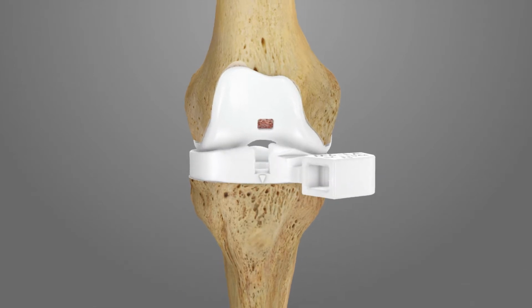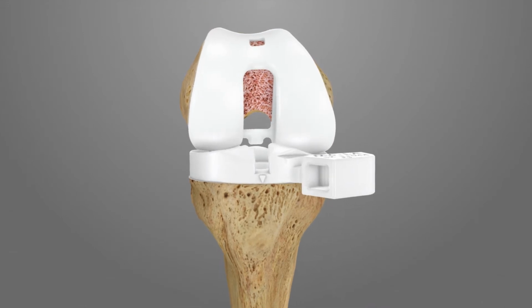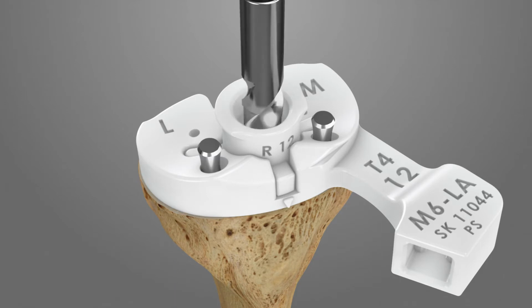Bring the joint through a range of motion and assess balance and ligament tensioning using the selected T4 iJig. If a thicker tibial assembly is desired, repeat with a larger T4 iJig. If the knee is properly balanced, pin the tibial preparation iJig into place using the tack pins. Place the tibial preparation drill tower, T4A, into the selected T4 iJig. Be sure the drill tower sits flush to the proper depth and drill angle. Drill the stem hole through T4 down to the physical stop.